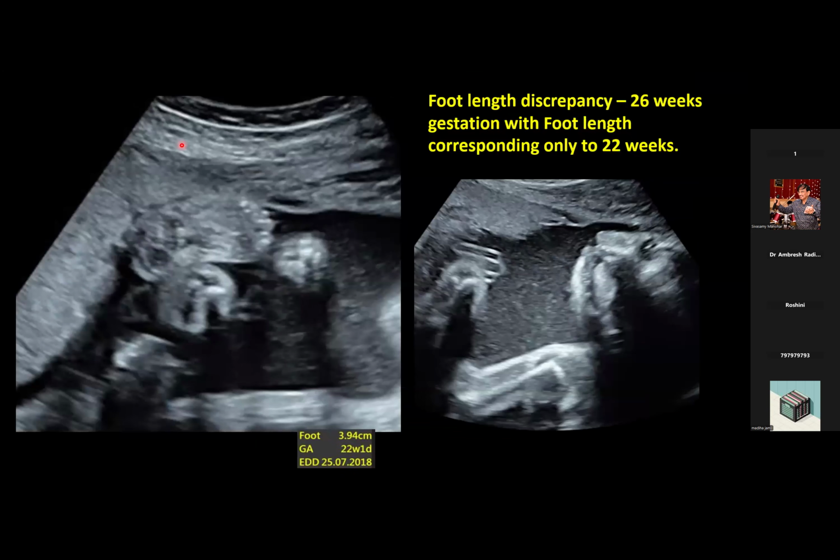So another size abnormality is foot length discrepancy. This is a 26 weeks gestation with the foot length corresponding only to 22 weeks. The toes are not very well made out. And you can see the limbs are persistently in the semi-flexed posture here.